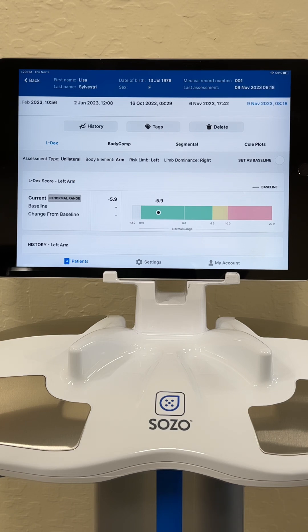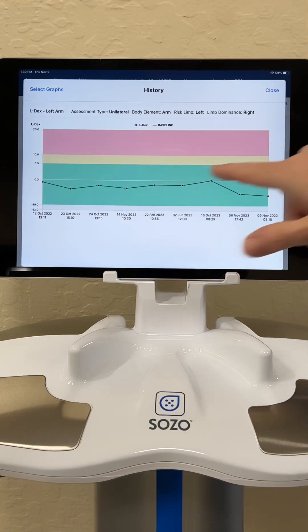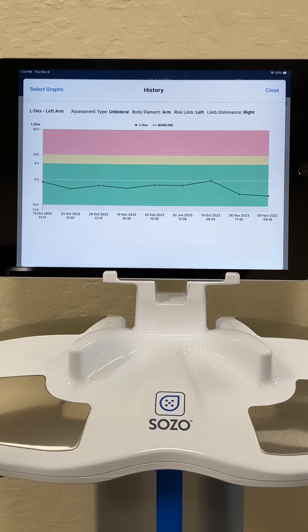My measurement is very good in the normal range. What I like about this is that we can actually look at the history and see where I am, where I've been, if I'm trending upwards or trending back downwards towards a normal level. This is a great visual that patients love — to see how treatment is going, what's going on with their swelling, whether they're getting better or worse, and how treatment has affected them.